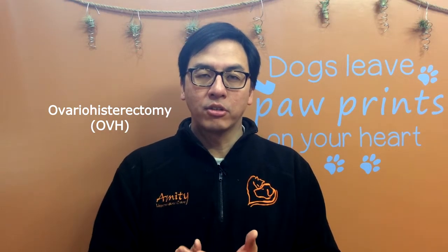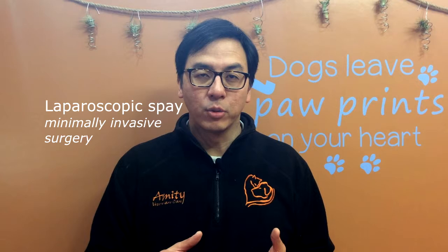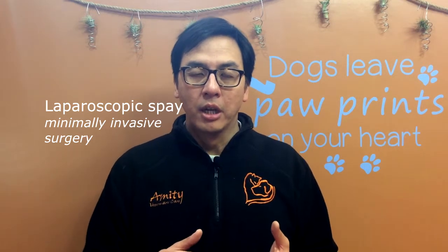As I mentioned, in the last 12-15 years, there's this particular method of keyhole surgery, which has been used for many years, much before that in human surgery, and finally it's transposed to vet medicine to utilize the benefits of it, as we have found. So the biggest difference between the two approaches is that the lap spay, or the keyhole surgery, as it suggests, is called minimally invasive surgery. It does not require a large open wound.